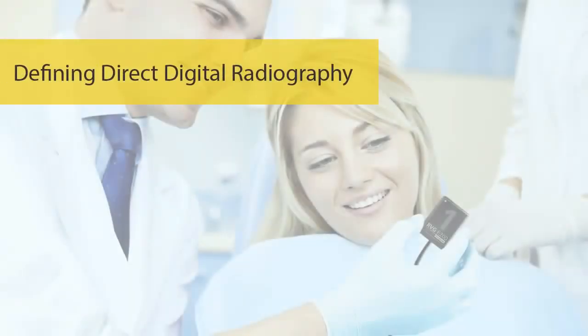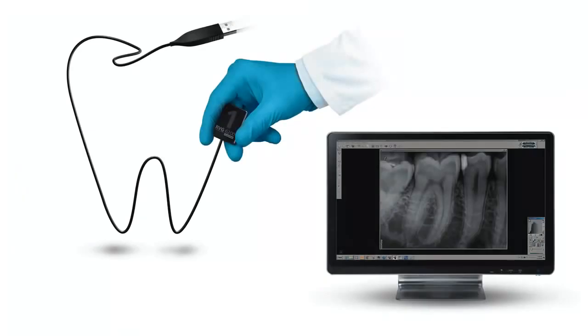Defining direct digital radiography. The RVG sensor is a direct digital radiography system, or DR. DR technology allows for instant image acquisition to the computer. Because the sensor is replacing dental film, you no longer need a darkroom or a film processor.